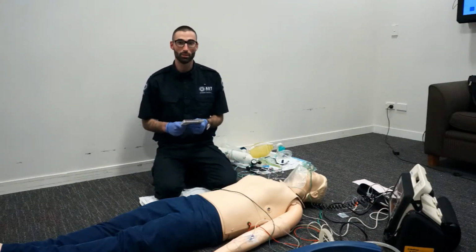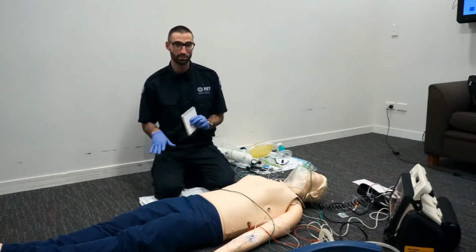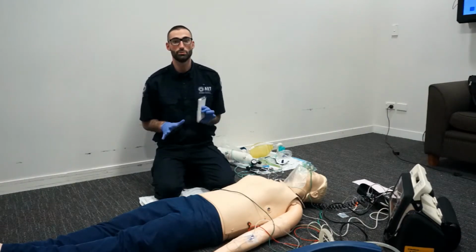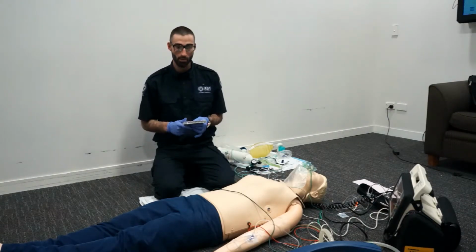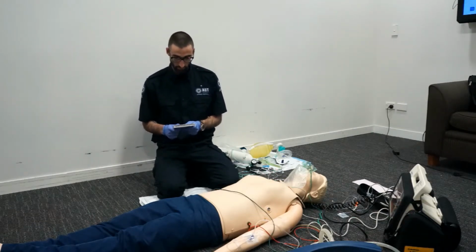To do this, I'll get my offsider to read this out to me. I'll go through each component and check it off and relay that information back to him. This is a double checking process to ensure that everything's been ticked off. So Jake, would you be able to please go through the first step? Attach nasal prongs without oxygen.